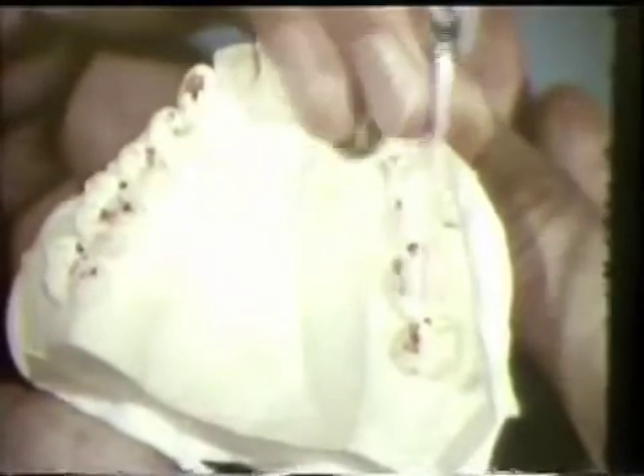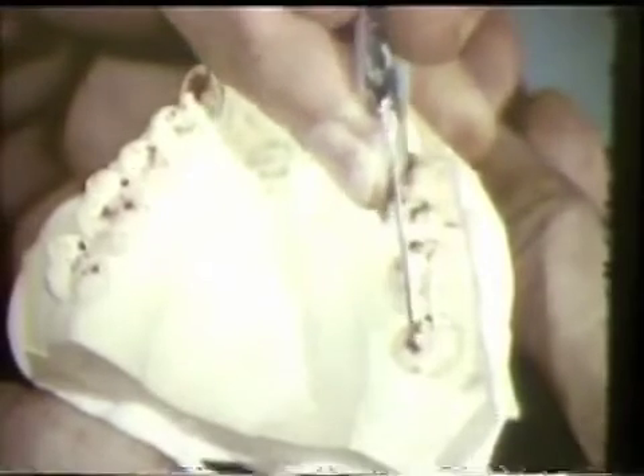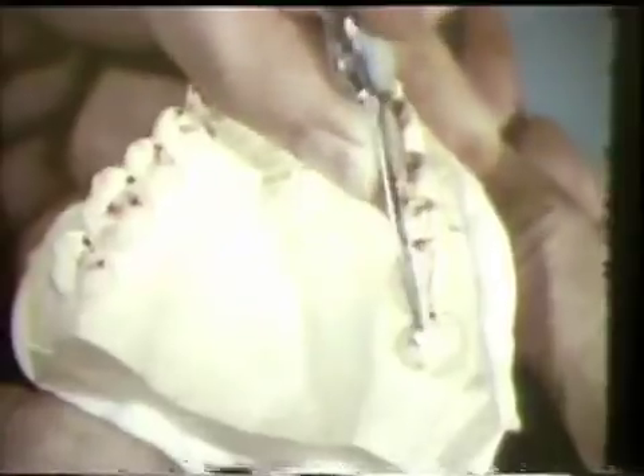The heavy balancing contact should be removed first. The buccal incline of the lingual cusp of the maxillary left second molar is reduced. A centric stop or holding contact at the tip of the cusp is maintained. The ledge on the cuspid, which triggers a jerky movement in working side excursions, is also removed.